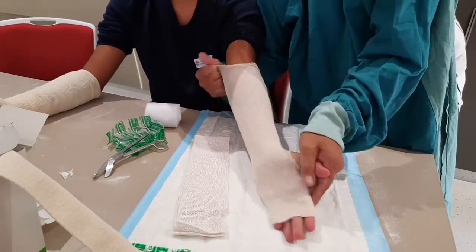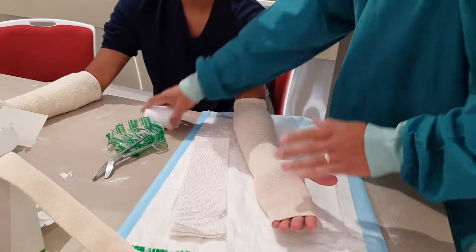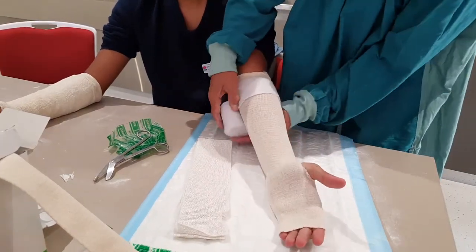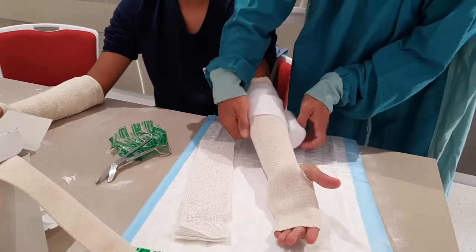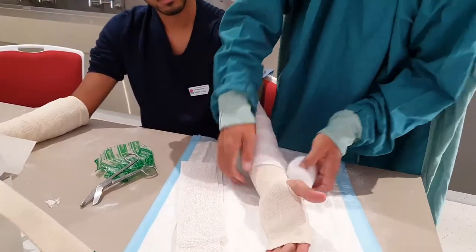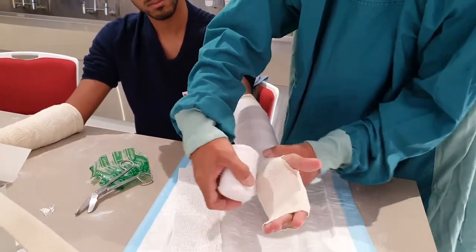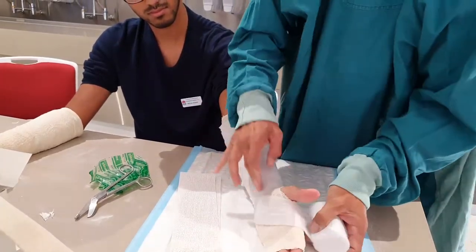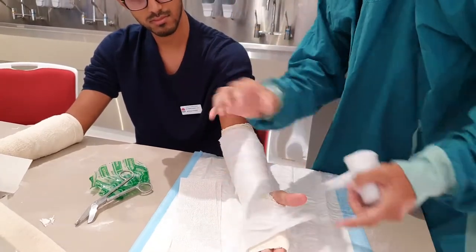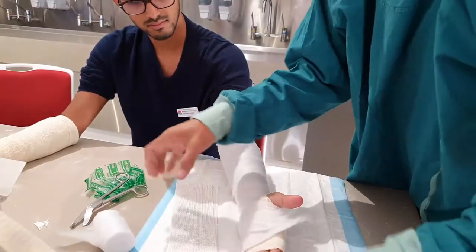Not everybody is going to be doing this filming a YouTube video. I'd like to get some of this cottony kind of bandage as a double barrier in between the plaster, so I'll just have that going around there. If this is a busted wrist, I'm going to concentrate on immobilization of this particular area.